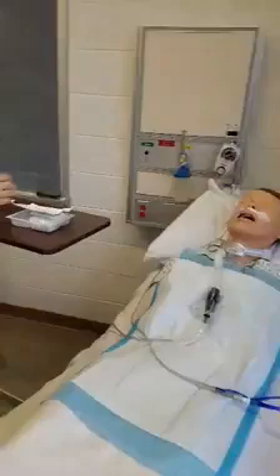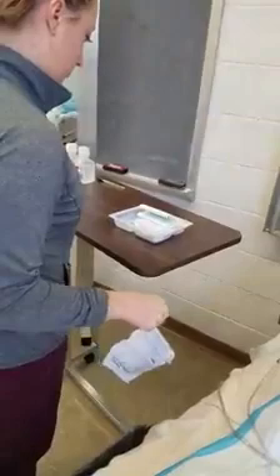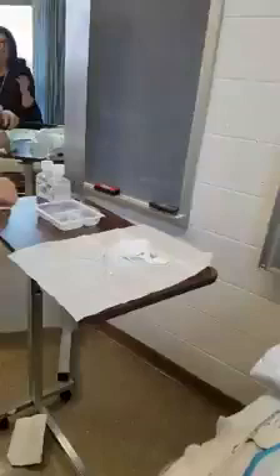She will open the tracheostomy kit, removing the lid completely. She'll set the wrapped sterile gloves to the side, and remove the waterproof drape, and create a sterile field on the table. She will then empty the contents onto the sterile field, using care not to let the tray touch the sterile drape. She'll then fill the tray compartments with the desired solutions, normal saline and peroxide per agency policy.